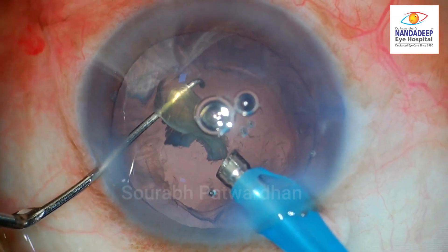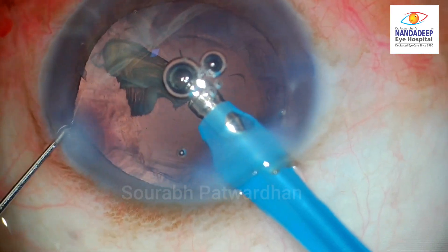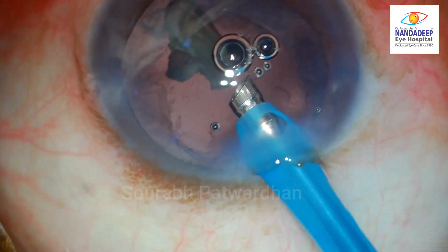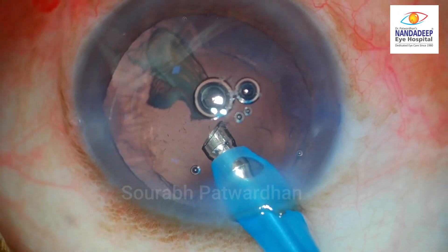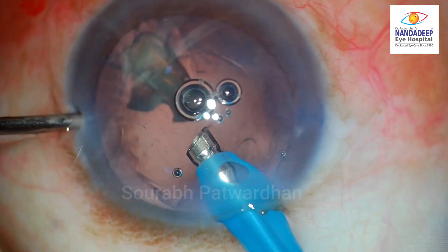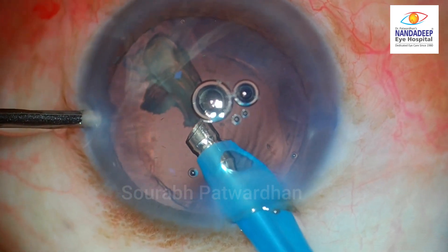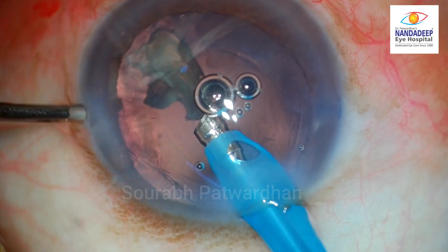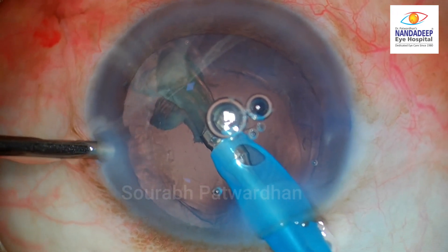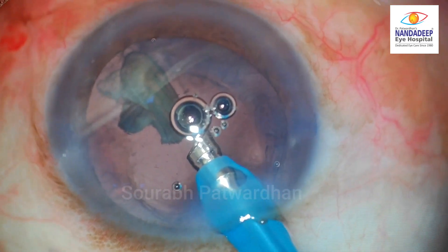And there you go. The PC has definitely ruptured here, and now the surgeon is trying to inflate the chamber with viscoelastic agent before the phaco probe is taken out. You have to practice this move in regular cases so that you can do it when it's needed, like in this case.